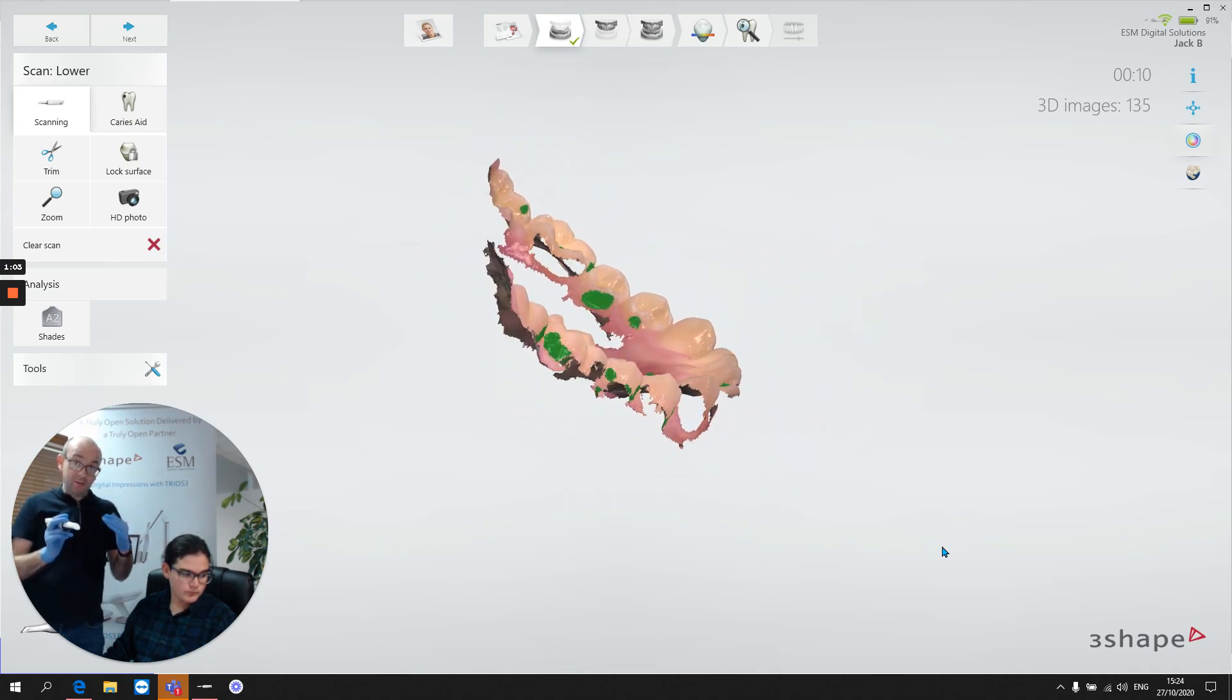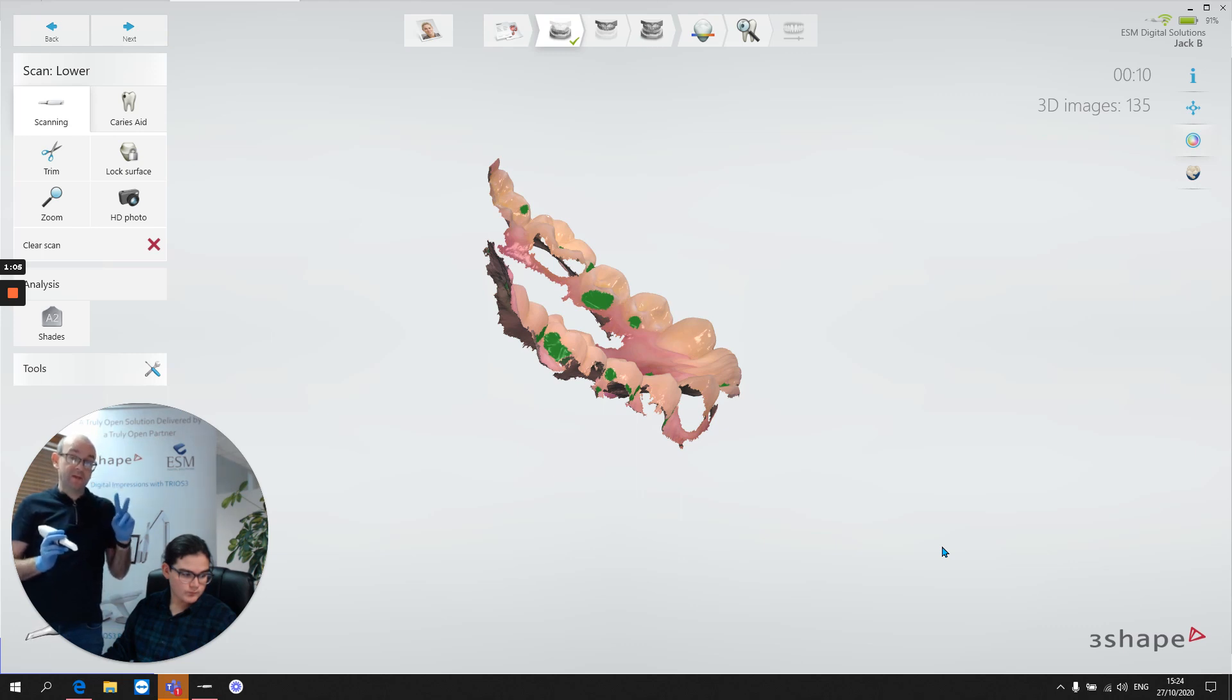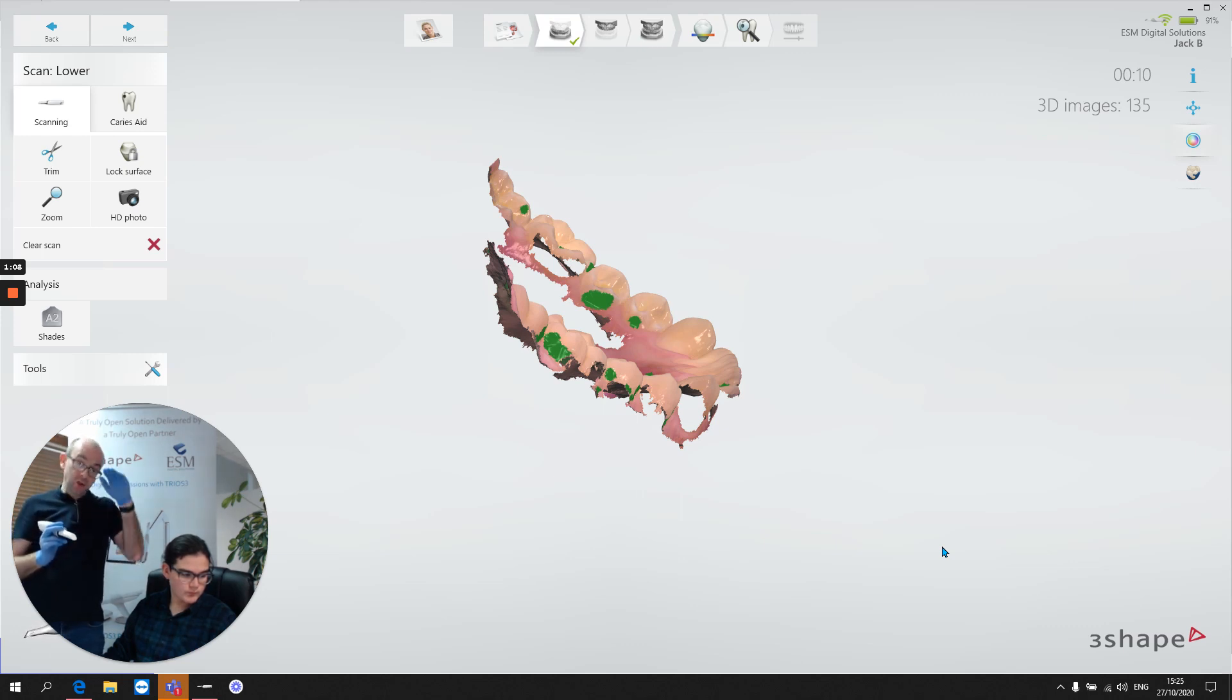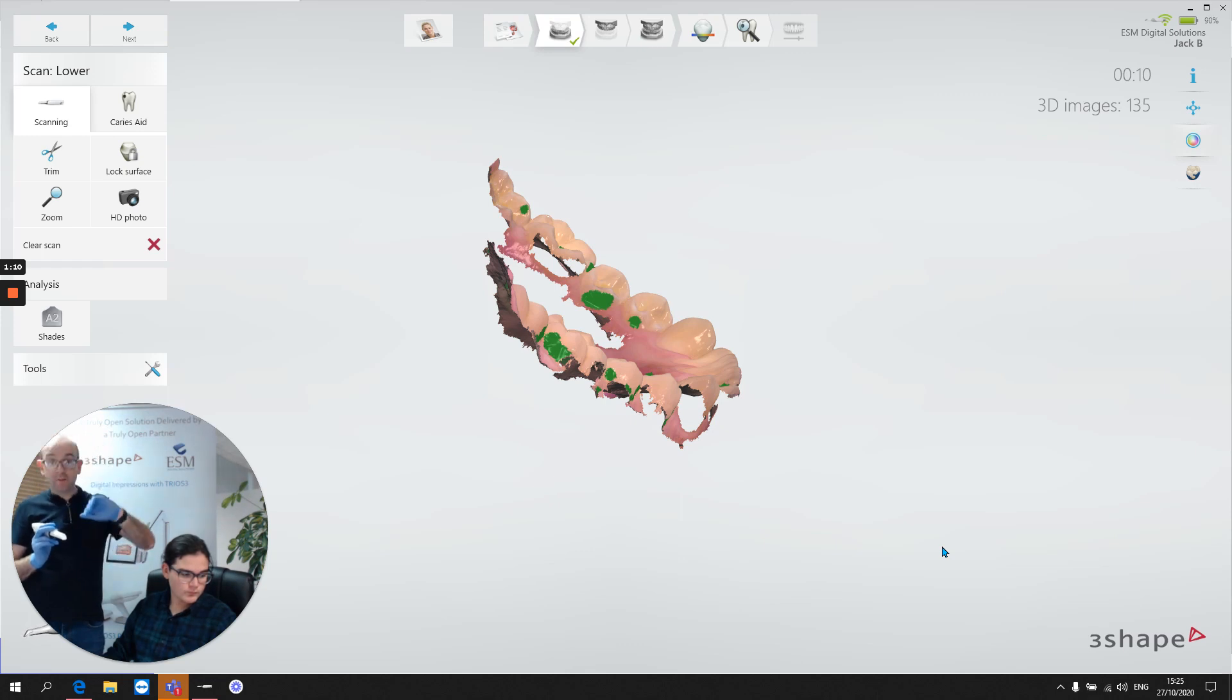That's a really good occlusal scan because there's two primary objectives to our occlusal scan. One, to capture the occlusal surfaces, and two, to capture some buccal and some lingual information. That's where we want to be.